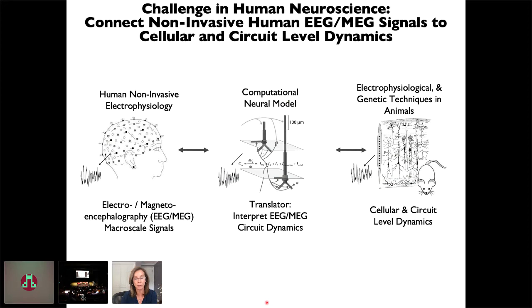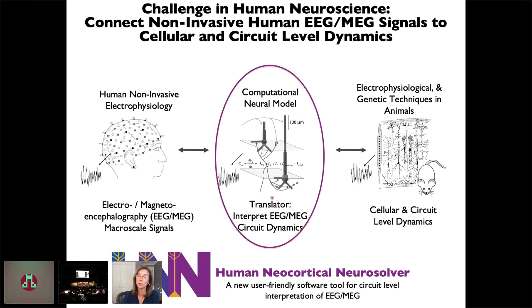And we've been developing this modeling framework over many years. And we've recently turned it into a software, Human Neocortical Neurosolver, that we've designed for the community to begin to develop and test predictions on the neural origin of your human MEG and EEG data.